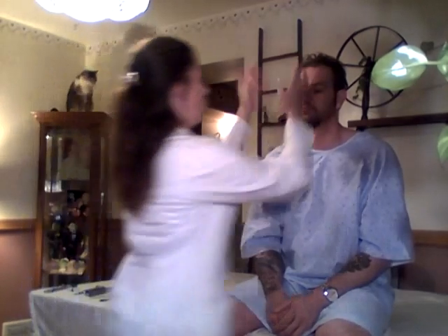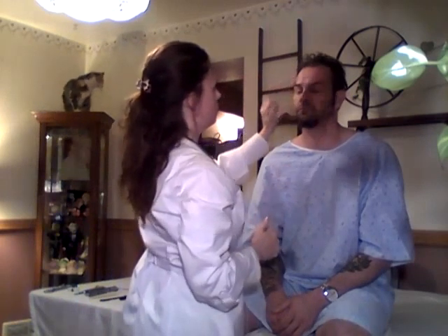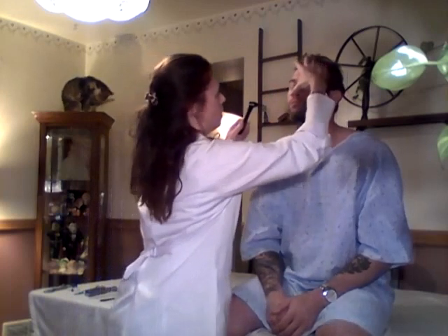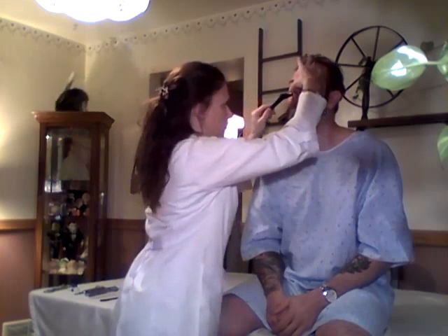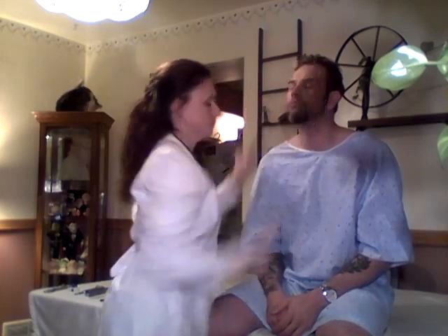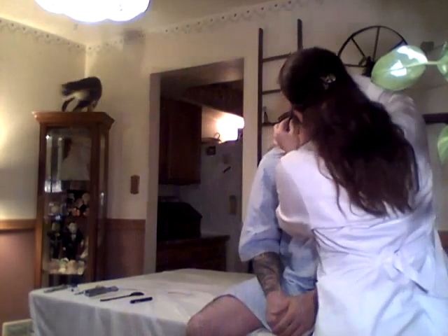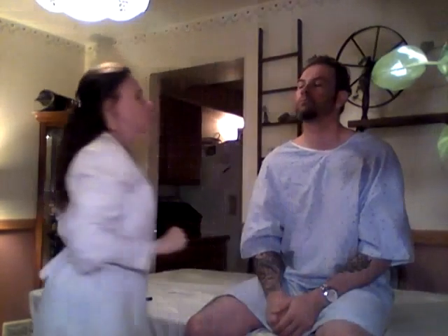Okay. Next, we're going to go over to the nose. And I'm just looking at the overall symmetry of the nose and the skin and also the septum for any obvious deviations, which there are not. I'm going to ask you to just put your head back. I'm just going to gently insert the otoscope, and I'm looking at the inferior and middle turbinates and the overall mucosa of the nose and the septum. And again on this side, the inferior and middle turbinates, the mucosa of the nose and the septum, and that looks good.